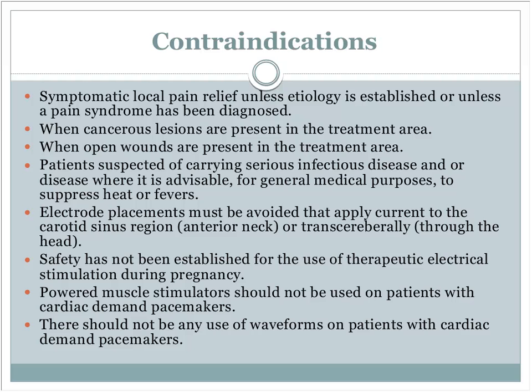Don't put the electrodes over the carotid sinus, the anterior neck, because that can disrupt the heart rate. Certainly you don't do it through the head. Upper cervical spine, suboccipital, absolutely fine, but don't put one electrode back there and one on the forehead. Okay. There's been no safety established for doing something like TENS during pregnancy.